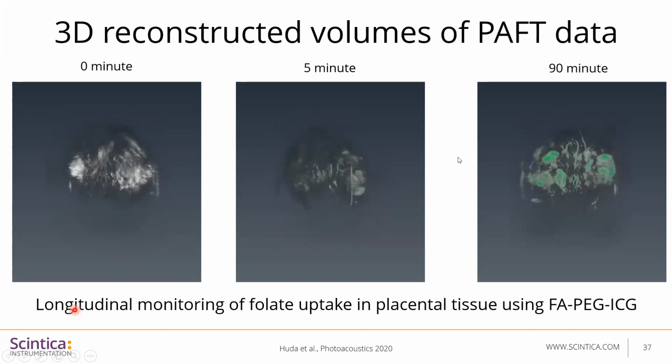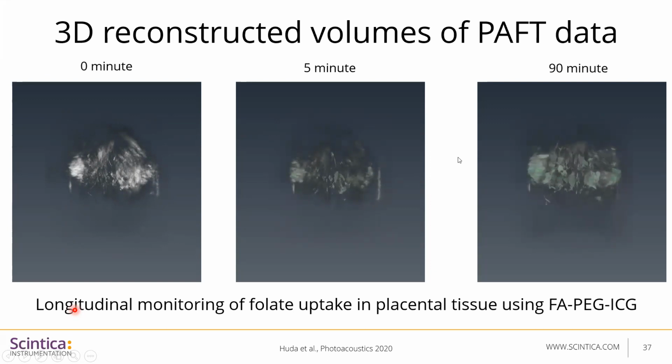But after 90 minutes, using photoacoustic imaging, we were visually able to see that there was a significant increase in the folate uptake. So this modality helped in the longitudinal monitoring of an exogenous contrast in the placental tissue, highlighting one of the advantages of the PAFT system.